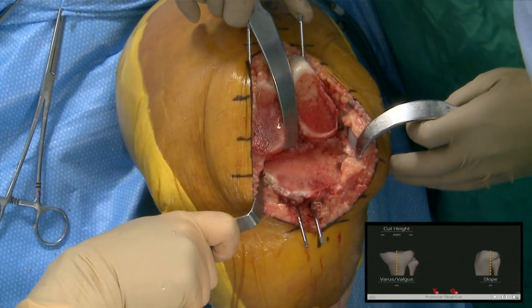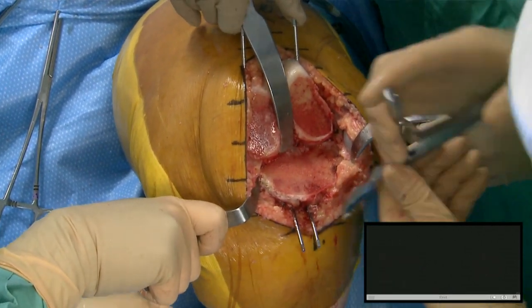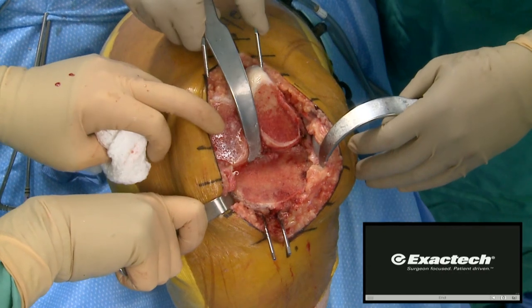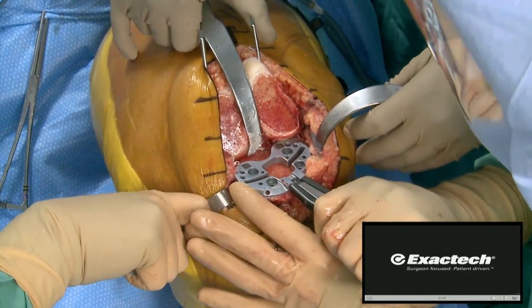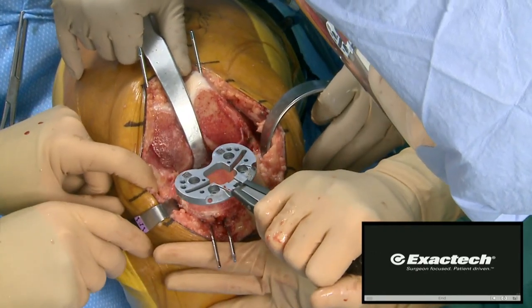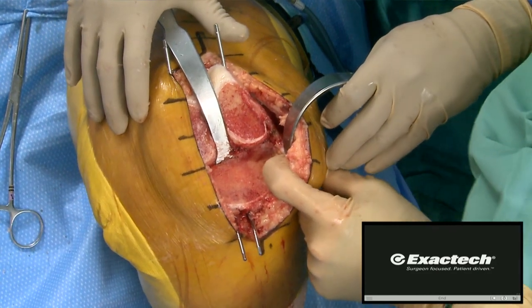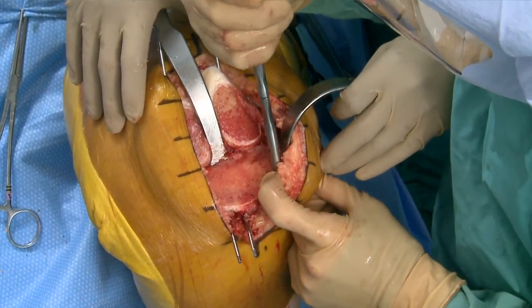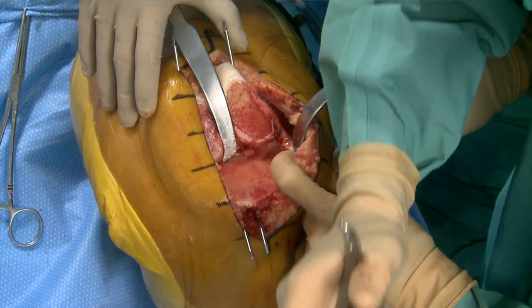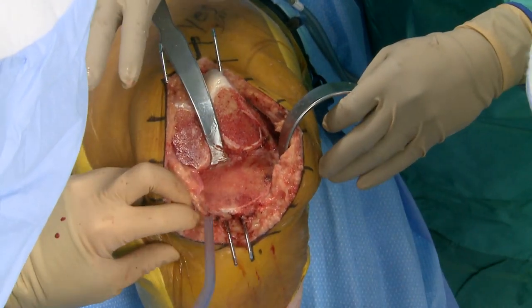In a really severe case, after you've done all your basic releases, it's not unusual that you have to downsize and lateralize. We're also going to size the tibia — that's a two and a half. We'll probably be a two or two and a half depending on the femur size. The Exactech system, like a lot of systems, allows for one up, one down, so I get a ballpark with the tibia and figure out my femur size later. This is a symmetric tibial base plate.